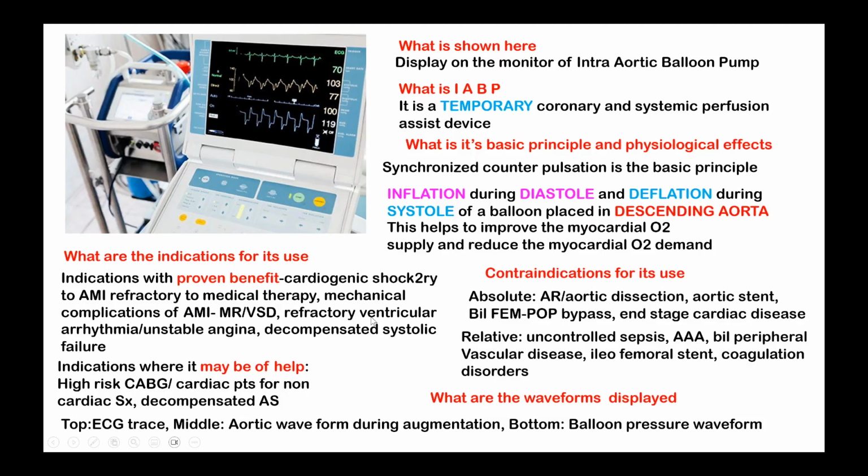The waveforms that are displayed in this: the top is the ECG, the middle is the aortic waveform during augmentation, which I showed in the previous slide, and the bottom is the balloon pressure waveform. So these are all the three waveforms you will see in the display of the monitor.